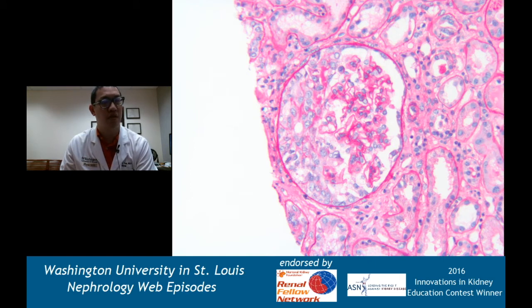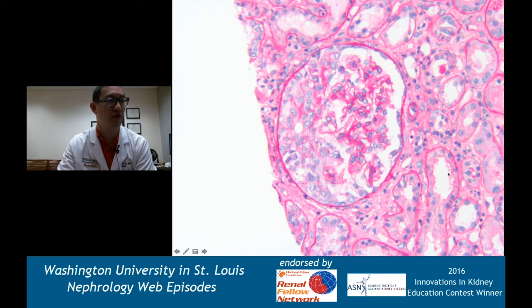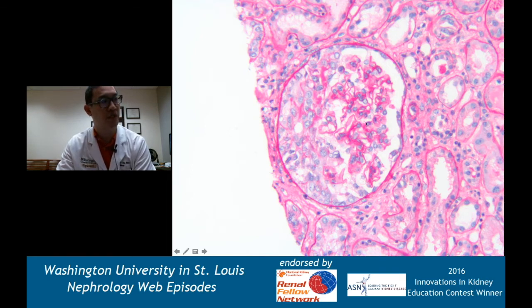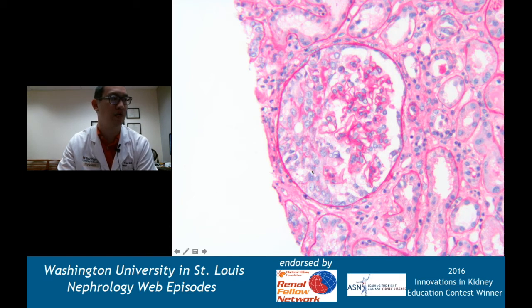This is a PAS stain. You can see the PAS-positive tubular epithelium - the tubules' brush border lights up on the PAS, which is different from the H&E. Here we have a glomerulus - the right half looks pretty normal, not a lot of endocapillary proliferation or mesangial expansion. But we have this large area within Bowman's space, which is a cellular crescent - that's inflammatory cells within Bowman's space.